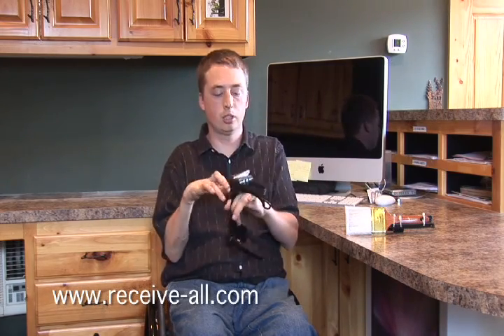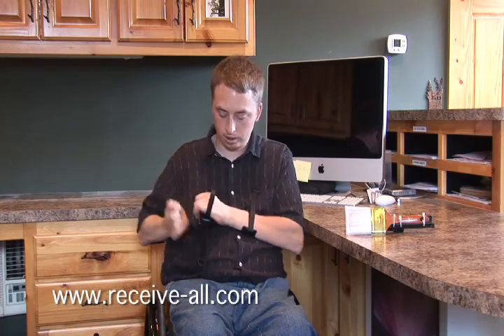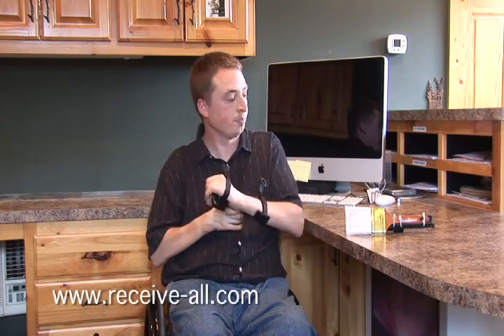I myself am a C6 quadriplegic, and so I have very limited strength in my hands and issues holding and manipulating certain items. So what the Receive-All consists of is an arm brace that attaches to your hand and forearm with two Velcro straps, and on the end of the straps is a D-ring that allows it to be manipulated by the people that would be using this item.